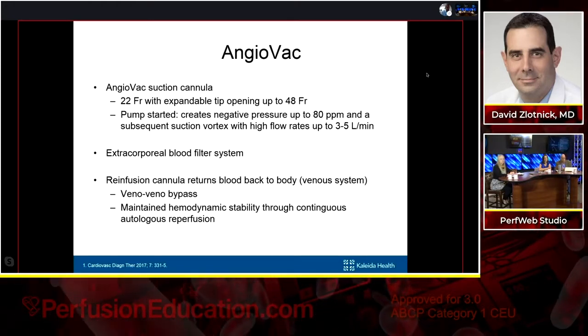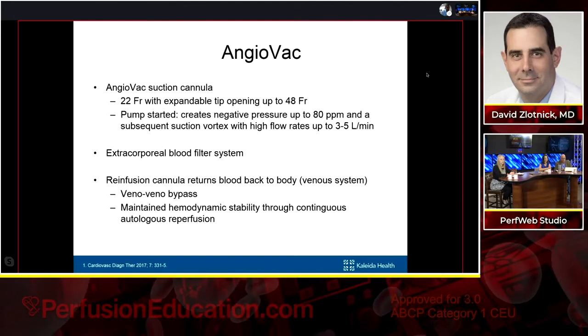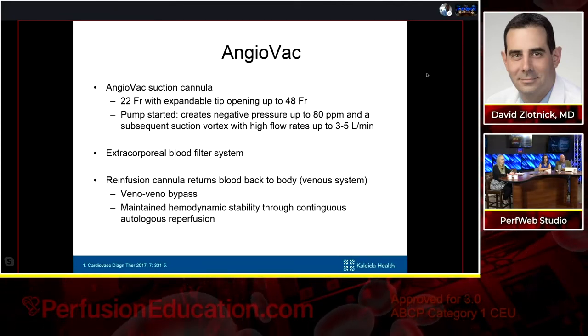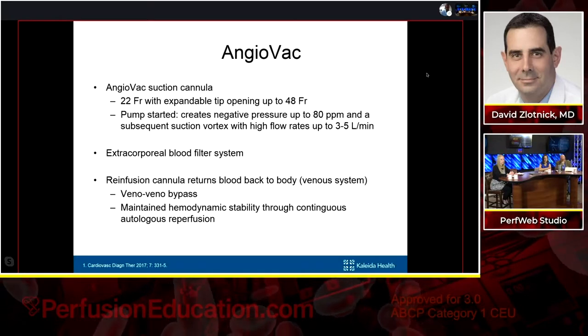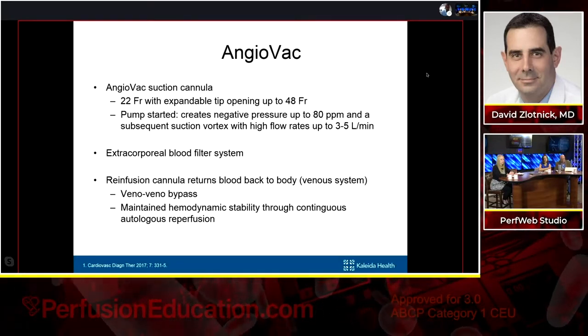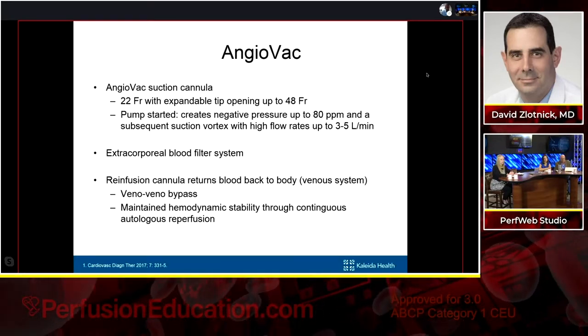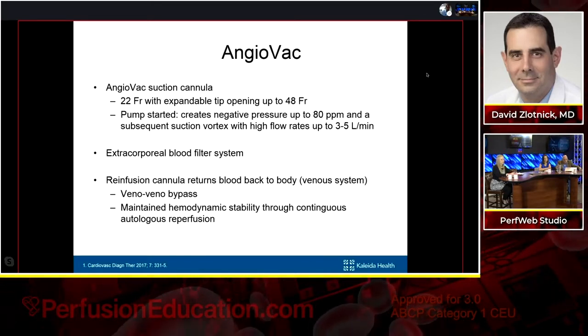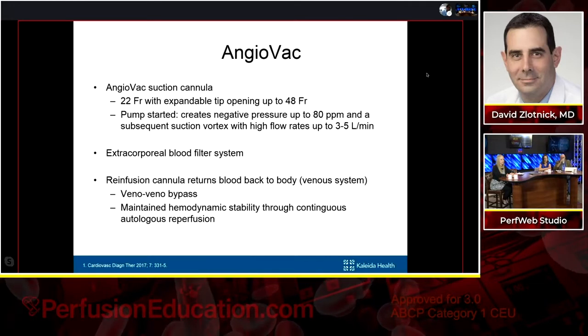As we know, this is an extracorporeal blood filter system. We have to give the blood back, or we'll exsanguinate the patient pretty quickly. The reinfusion cannula returns the blood back to the body through the venous system. So this is basically veno-veno bypass without the oxygenator. And this allows us to maintain hemodynamic stability through the contiguous autologous reperfusion of blood back to the patient.